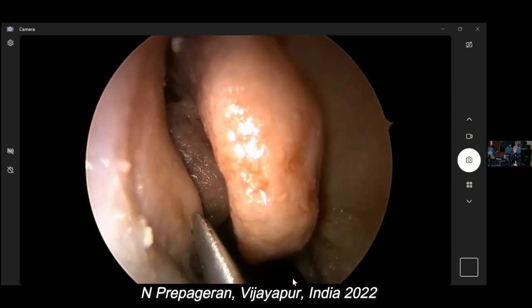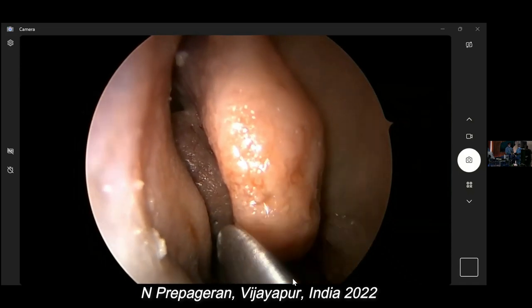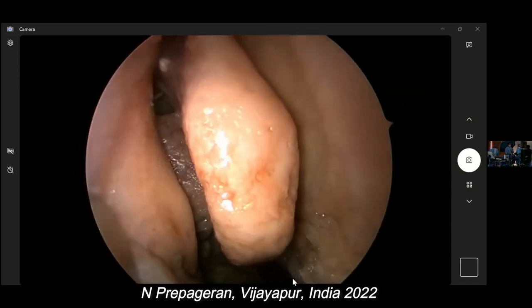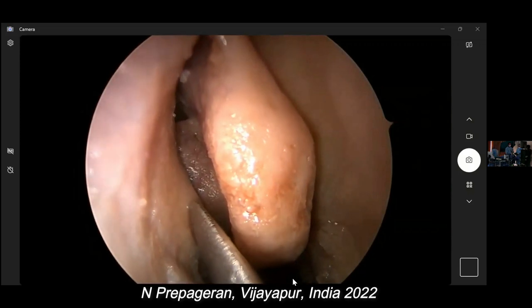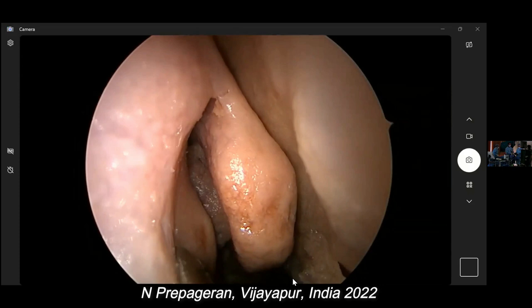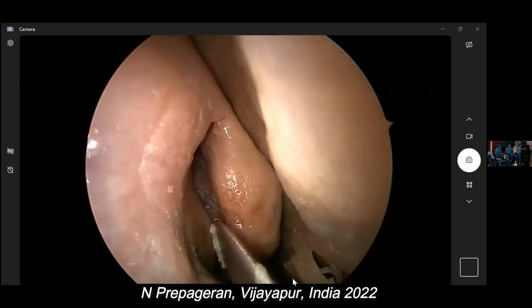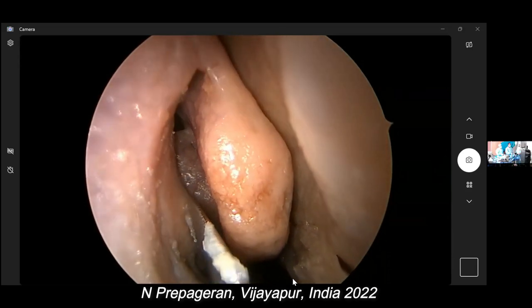There are two ways of doing an uncinectomy: an antegrade and a retrograde. I like to do an antegrade resection. So you touch this, you can see where it's touching, exactly along the maxillary line here. So your lacrimal sac will be above here.